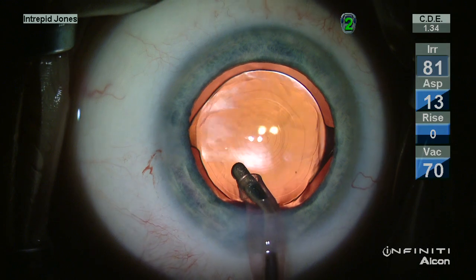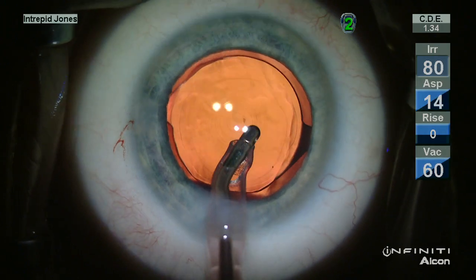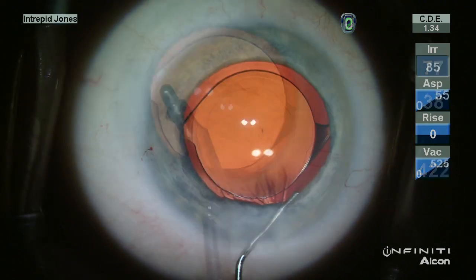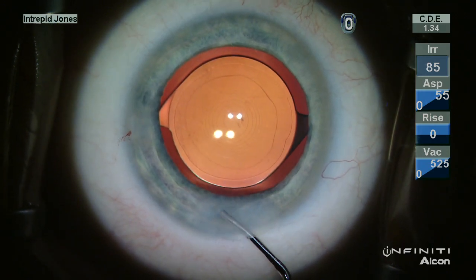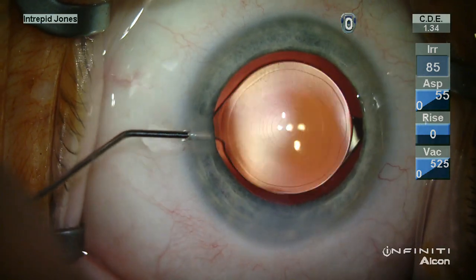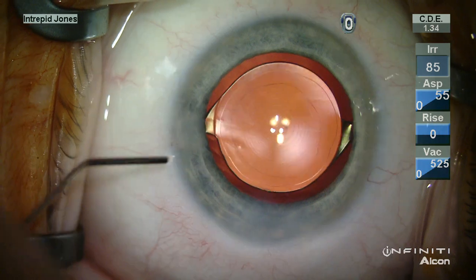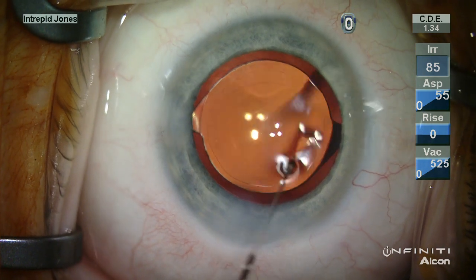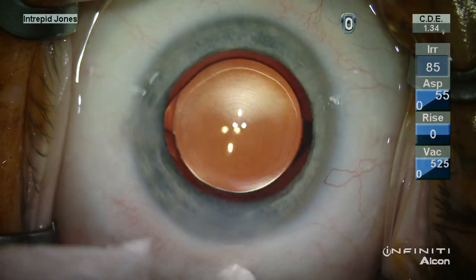The haptics are extended and then with OVD removal it's important not to go behind the lens, but simply to go to all four quadrants and remove material from the fornix of the bag, followed by evacuation of the viscoelastic from the endothelium. I like to flush the angle to ensure that no additional OVD remains in the eye, and a final positioning based on the overlapping of the two Purkinje images from the microscope ensures a very centered lens. I feel this aids in the postoperative result for these patients.